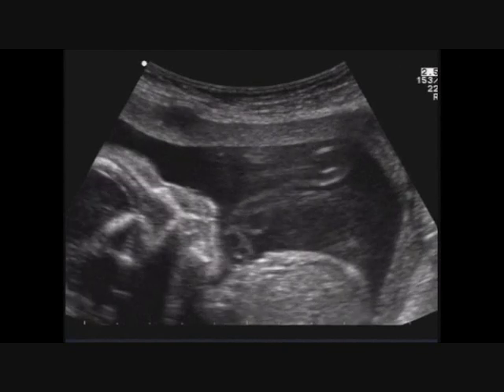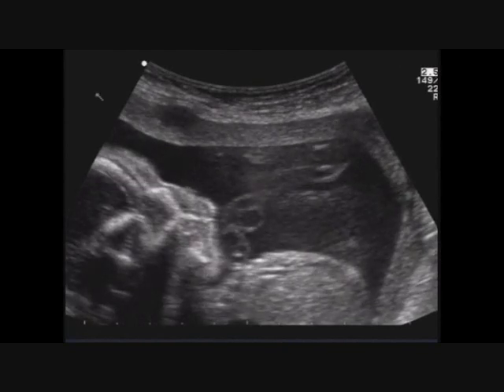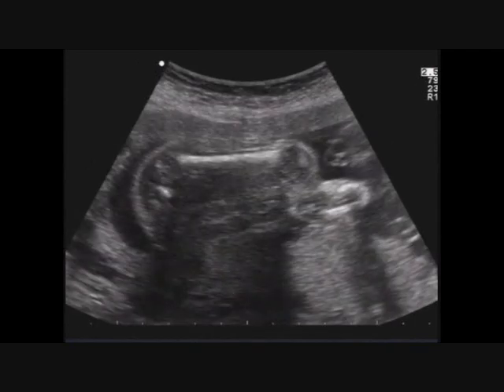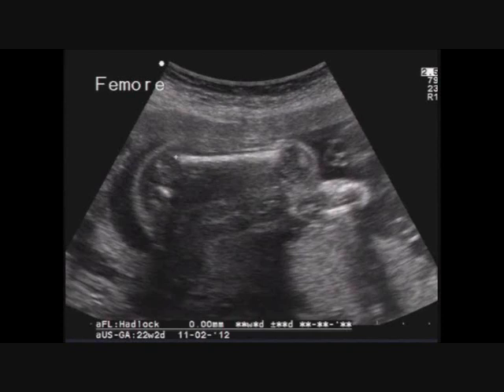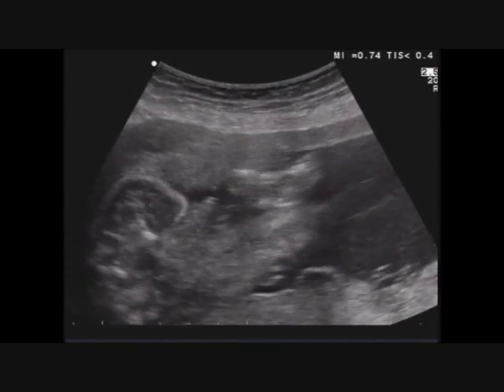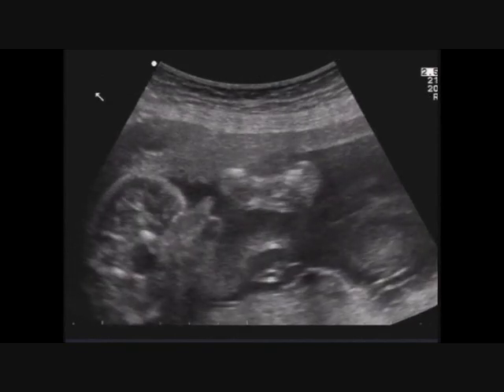You need to see all the organs, and I show you the extremities, and why? Because in many skeletal malformations there is corpus callosum agenesis. The most important examinations that you need to request are genetic counseling and especially magnetic resonance. And why? Because magnetic resonance can confirm the diagnosis.